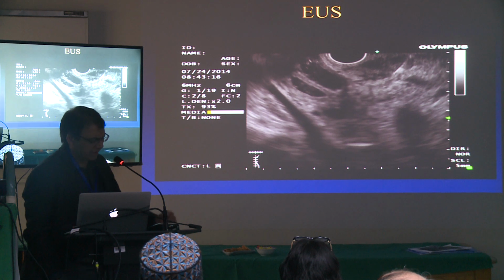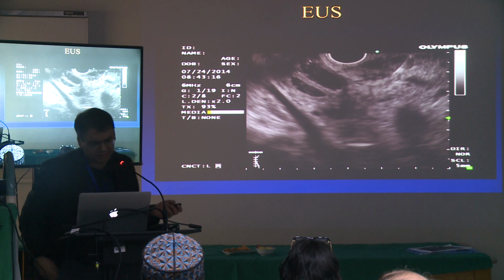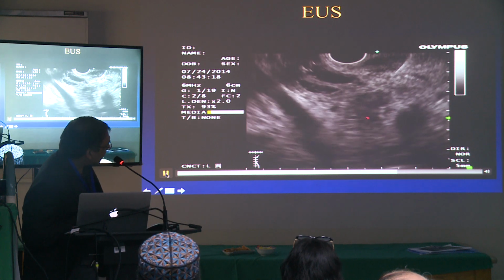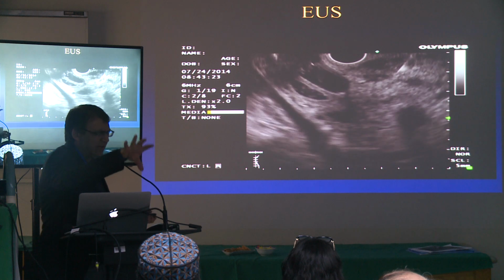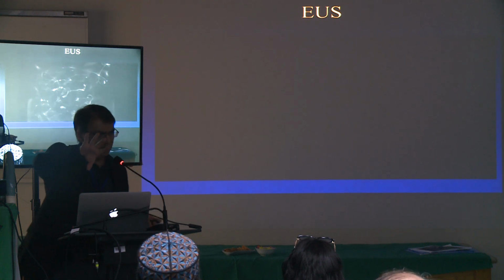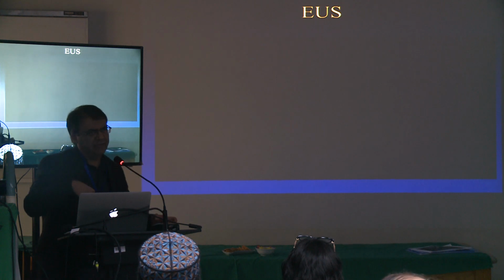So you mean like a cyst there? That's what you're trying to say? Okay. And anybody else? Okay. So it looks like a pancreatic duct extending through that area. So that fluid looks like it's really a pancreatic duct. And so there is some hypoechoic area around that. So FNA was performed. I'll come to FNA in a minute.